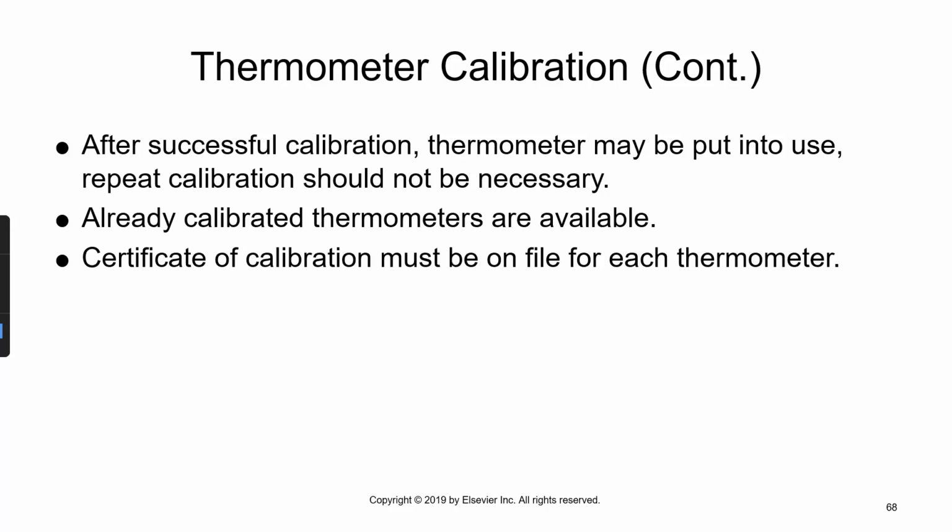thermometer. This seems crazy, but this is something that we keep track of in the laboratory because temperature is so important for things operating and functioning properly. And we'll learn a lot more about that, like I said, when we talk about the molecular diagnostics and immunology courses, how important temperatures are when we're running certain rapid kits.